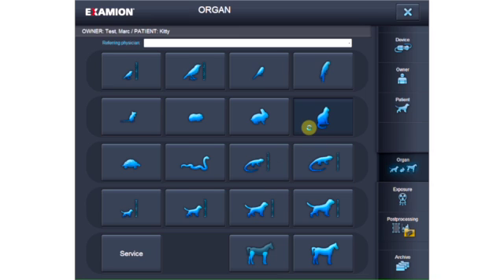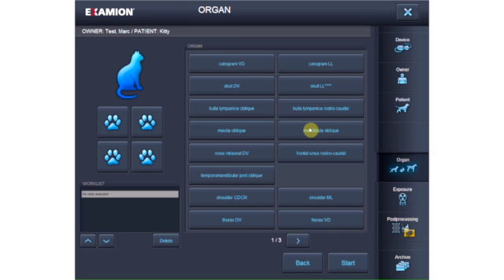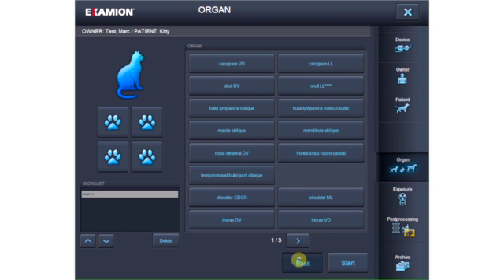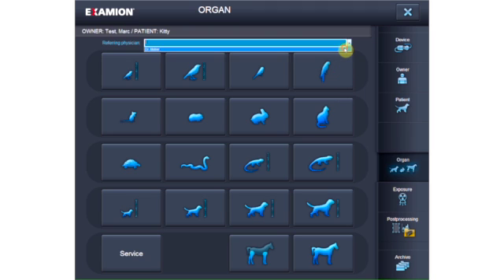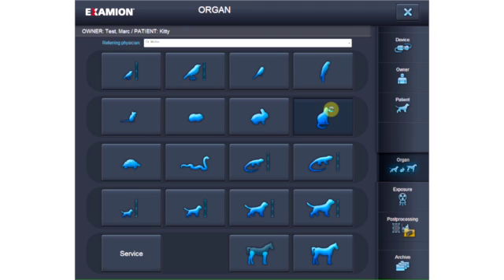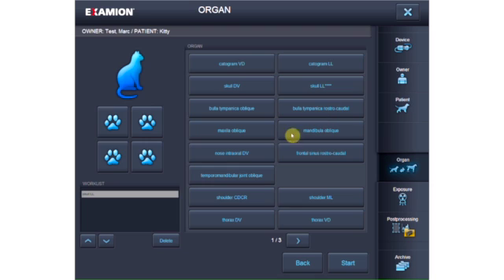After the patient is selected, the order is generated by selecting the species and the organ. You can also enter the name of the referring physician. The orders can be deleted and a new species can be selected.